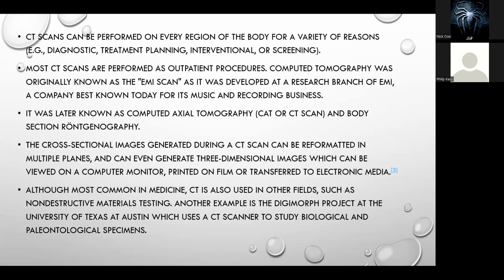Now, they can be performed on every region of the body for a variety of reasons, whether to diagnose a disease, whether to plan treatment, like those who have cancers and are going to have radiotherapy done, they use it to map out the treatment.